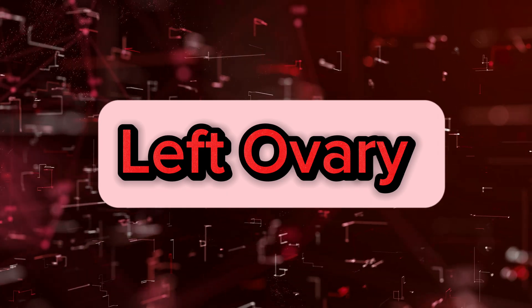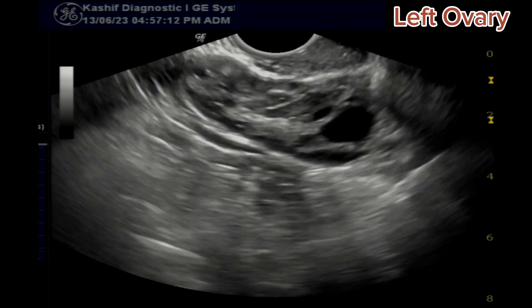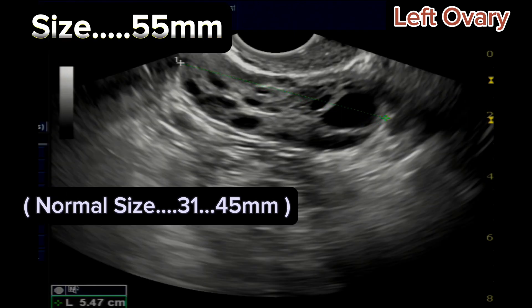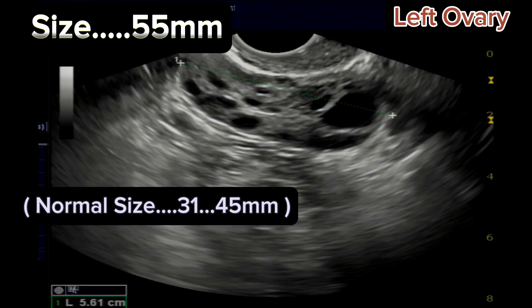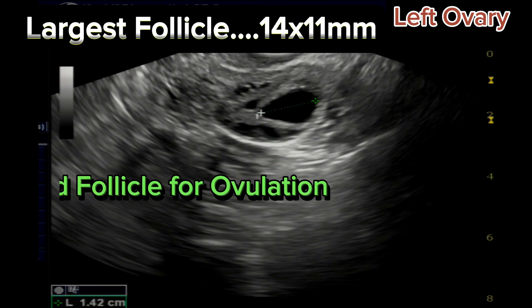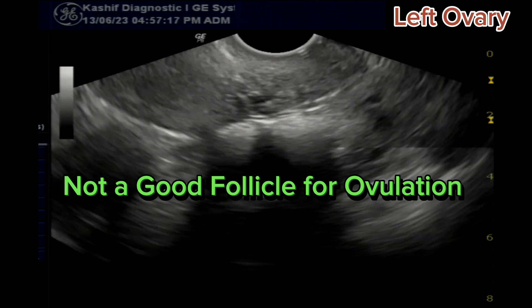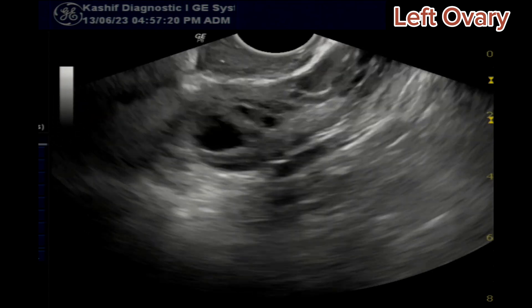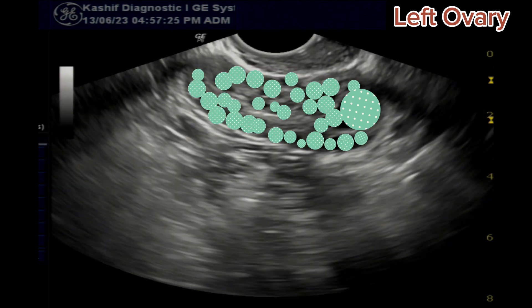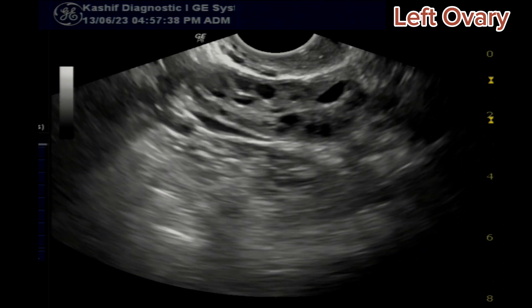Now the left ovary is visualized. It is also enlarged and elongated, with a size of 55 mm — normal is less than 45 mm. The largest follicle is 14 x 11 mm, but this is not a good follicle at 12 days. It is mildly elongated and mildly irregular. No other dominant follicle is seen. This ovary also contains multiple small follicles, at least 25 in number, sized 3 to 5 mm.